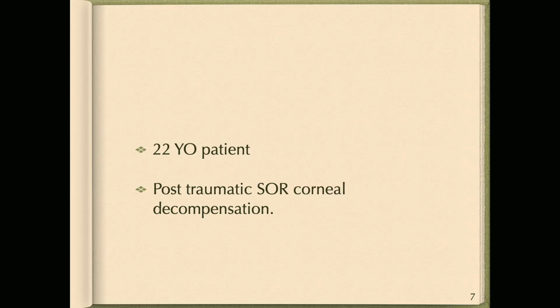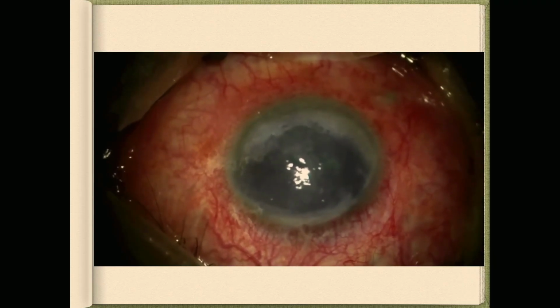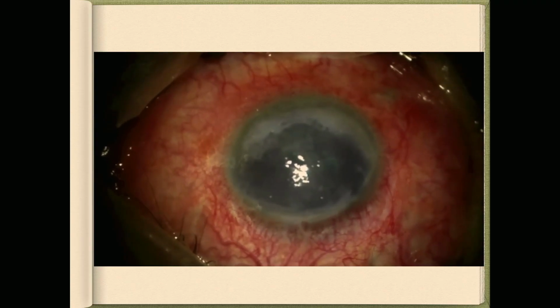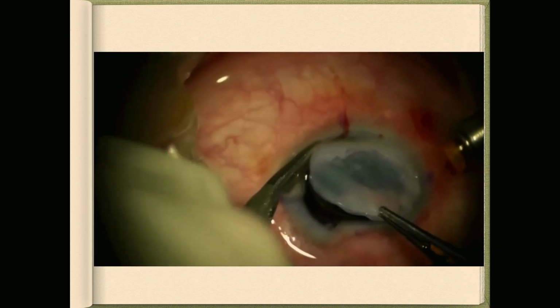It was trauma with traumatic retinal detachment, done vitrectomy and silicone oil, and after removal of the silicone oil, he has this cornea with decompensation.